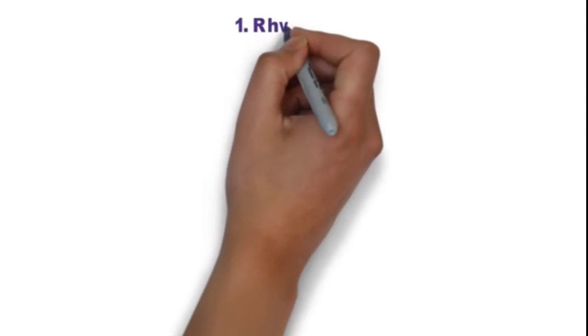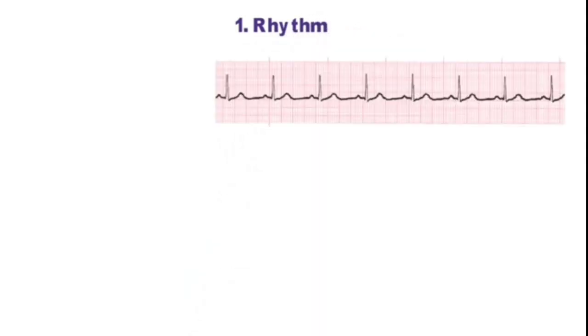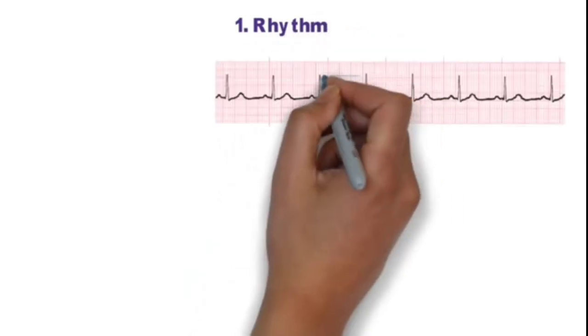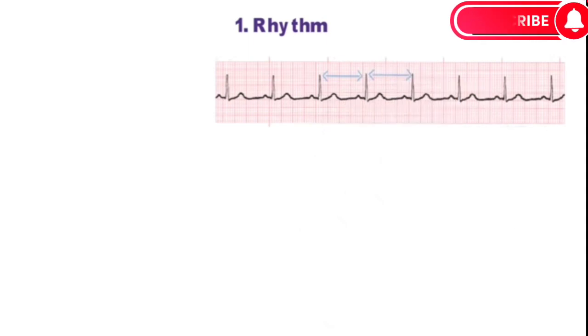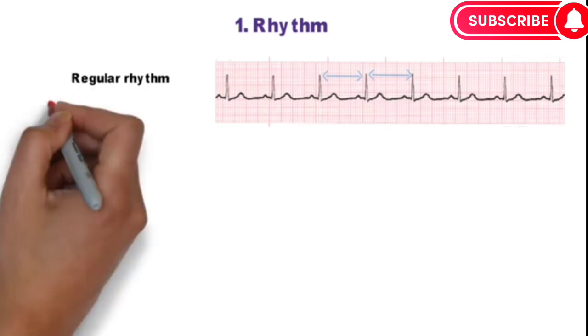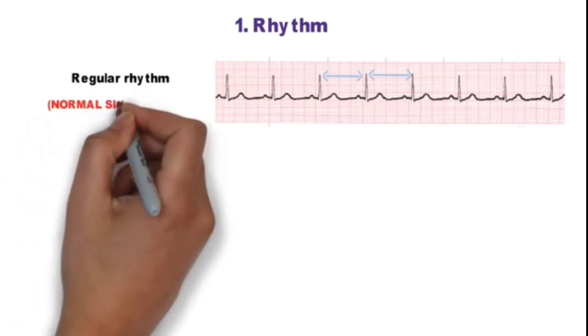First step is to check the rhythm. We check RR interval - as in this ECG, RR intervals are equal and there is a P wave before every QRS complex. So this is a normal sinus rhythm.